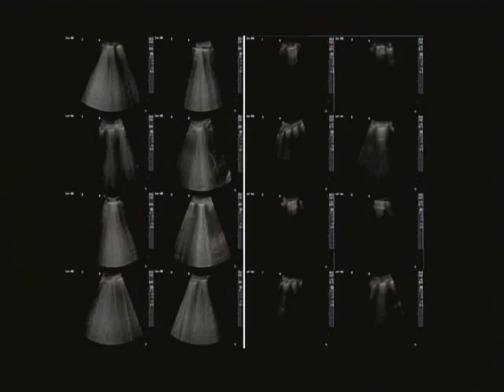And this is a great case that I show all the time, but this is basically a patient who came in, all 8 areas were very fluid overloaded. You see the white lines everywhere. And all we did was put them on CPAP and check them an hour later. And you can see that the CPAP pushed the fluid out so that now, we knew the patient was better anyway, but this is sort of just to prove to you that this is a real-time measure of responding interstitial space. So the fluid goes away, the B lines resolve, and it resolves in real time.